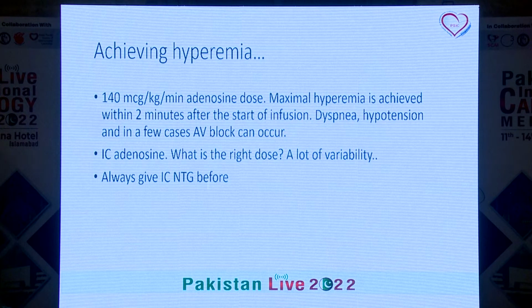But if it doesn't, then it may mean that we haven't achieved maximal hyperemia, and that's why the FFR is not correlating with the iFR. And always give intracoronary nitroglycerine before you're doing your adenosine to make sure there is no spasm element contributing there.